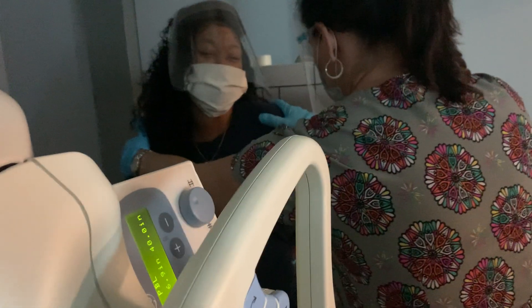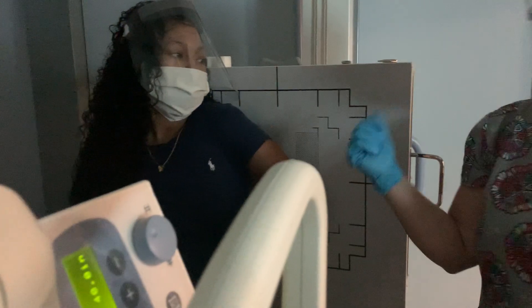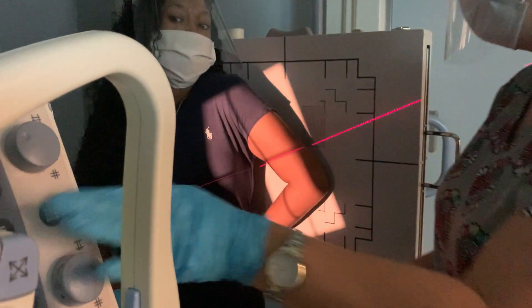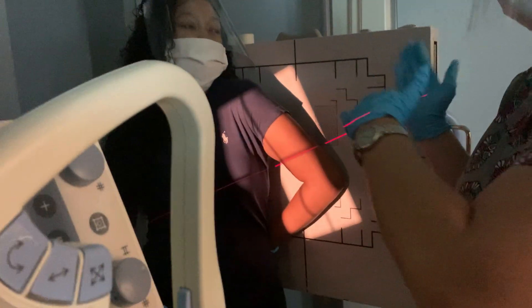You don't think it's going to work? So if this were the situation and the patient were not able to get her shoulder relaxed, what could we do? We could do an AP. No, this is AP. So we're going to do a PA.